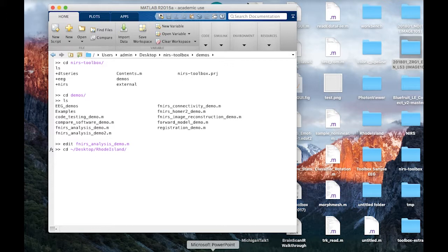So you can upload additional demographics from an Excel file or CSV, or it'll actually load .sav files from SPSS. Don't tell the SPSS people, but I hacked their data format because it technically is proprietary. But it directly reads .sav files.